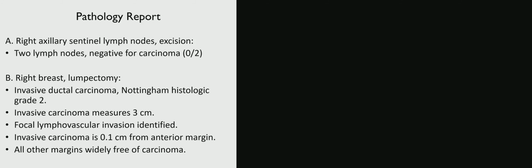And this one is invasive carcinoma. You can see these blue cells, they're infiltrating. They don't have this normal structure anymore. They infiltrate into surrounding tissues and have access to lymphatic channels and blood vessels, and then they have the potential for distant metastasis.